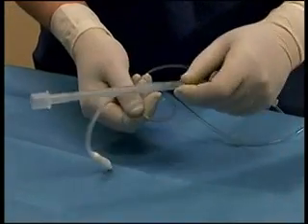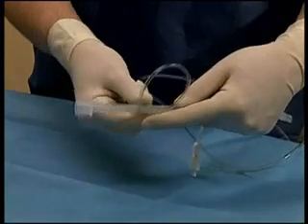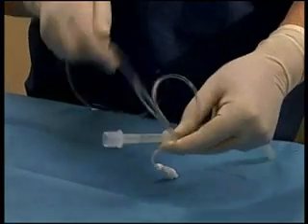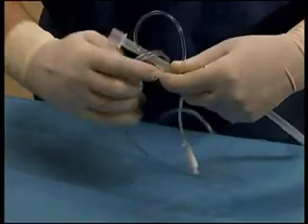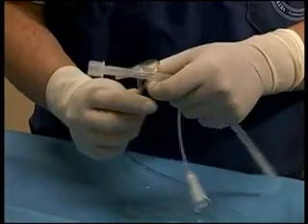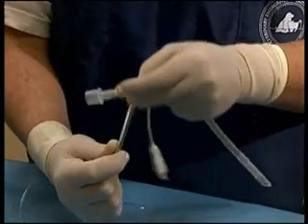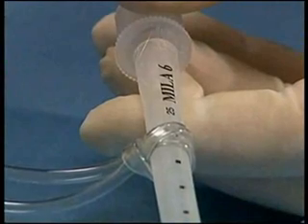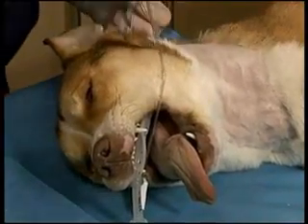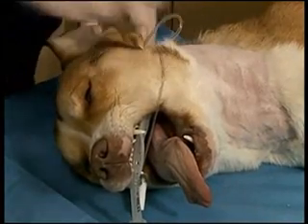In order to secure the tube, a pre-cut length of IV tubing is used. Strands are doubled and wrapped around the tube and then inserted through the loop that is created. This tubing should be pre-stretched to allow it to secure tightly on the endotracheal tube. The knot is locked down and can easily be released by using the thumb pushing out on the outer edge of the loop. This can then be tied around the back of the animal's head. This tubing is preferred because it does not get caught in long fur and when wet is still easily released.